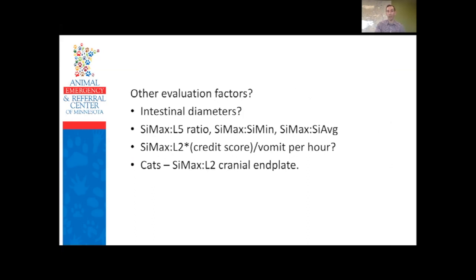Besides looking for obvious foreign material and outflow obstruction, there's a lot of literature on measuring intestinal diameter ratios. The commonly referenced measurements include: the maximum small intestinal diameter to the mid-body of L5 ratio, the small intestinal max to min ratio looking for two populations of markedly different sizes, and the max to average. For cats, the small intestinal maximum to the L2 cranial end plate is what's published.